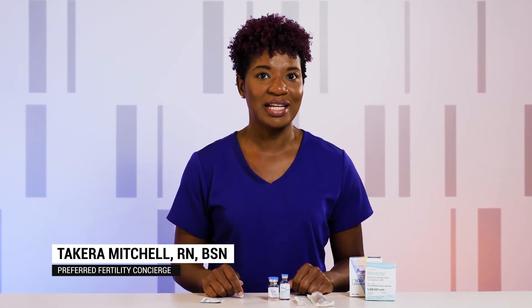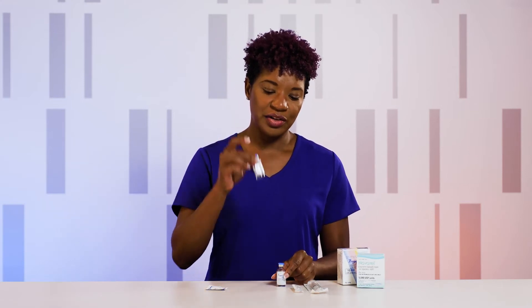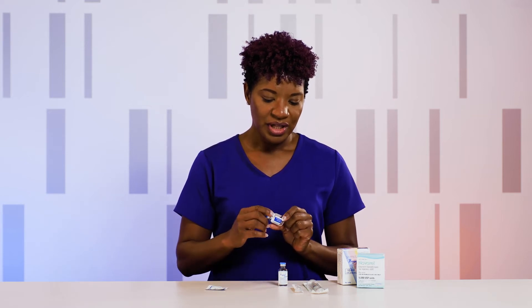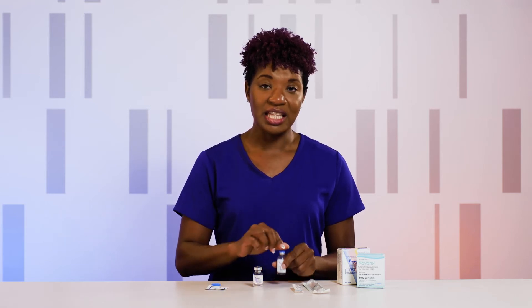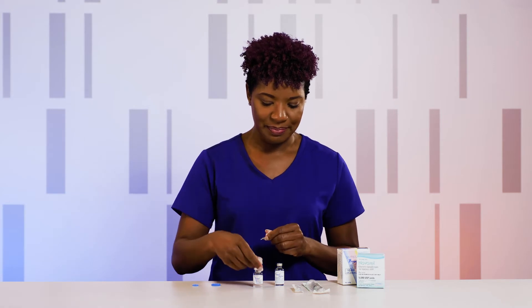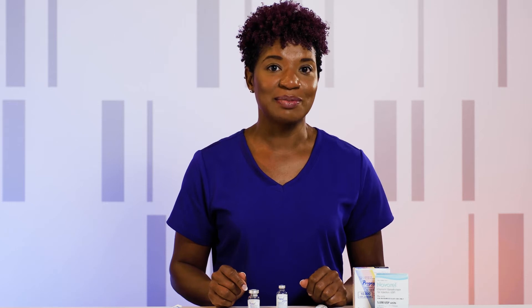I'm going to be showing you how to mix Pregnyl or Novarel for your trigger shot. These medications may be interchangeable — it will just depend on which one has been ordered for you. Each medication will come in a box with a vial of powder and a vial of liquid for mixing. Go ahead and remove the top of the powder and then the top of the liquid. Use an alcohol pad to wipe the top of both vials, and be sure that you check the expiration date before beginning the medication.